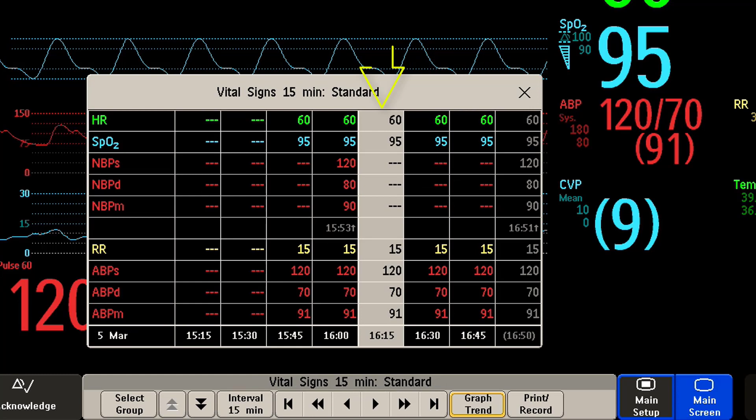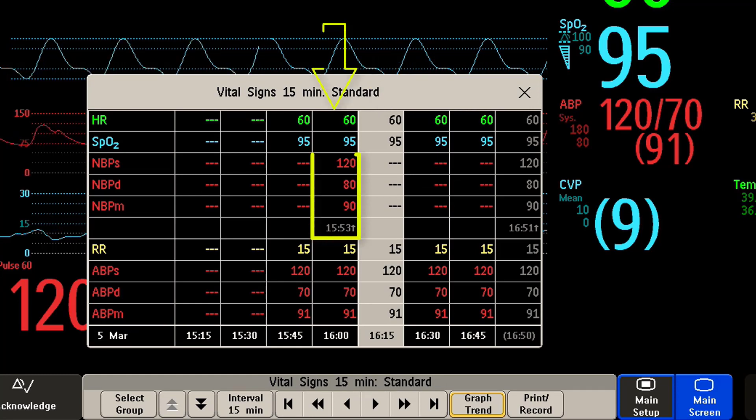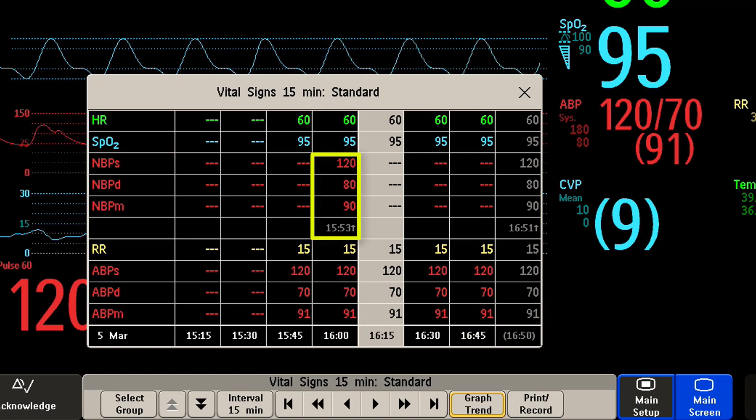The currently selected column is highlighted and look here, you see an aperiodic measurement with a timestamp.